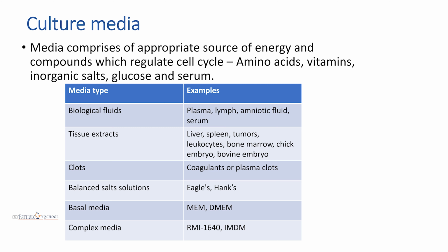Basal media, MEM, which is minimal essential media, and DMEM, Dulbecco's modified Eagle's medium, named for Dulbecco, a scientist who worked on it. So he modified the media, he increased the amount of glucose and decreased the amount of sodium salts, and he produced the DMEM media. And these complex media were further developed by laboratories, and they were customized according to their needs.